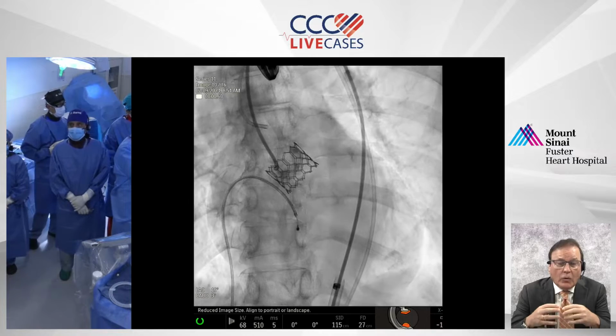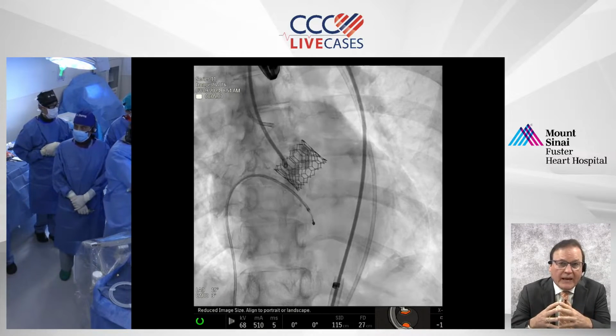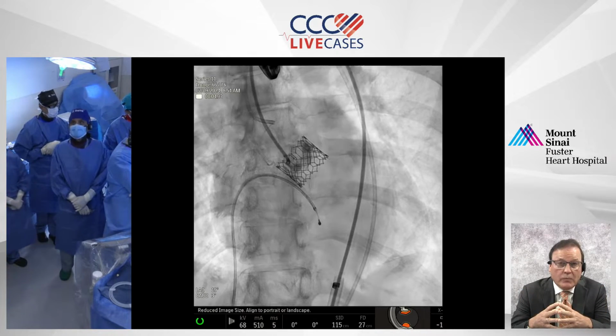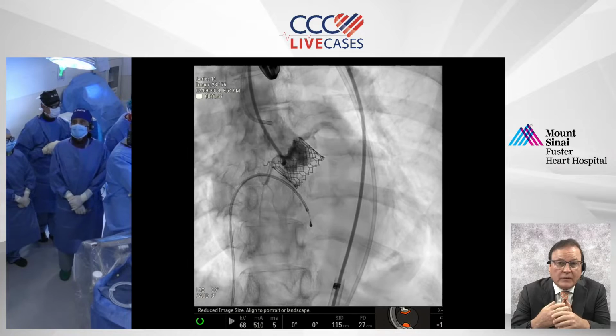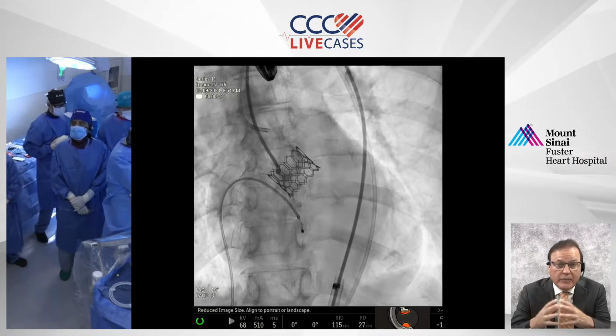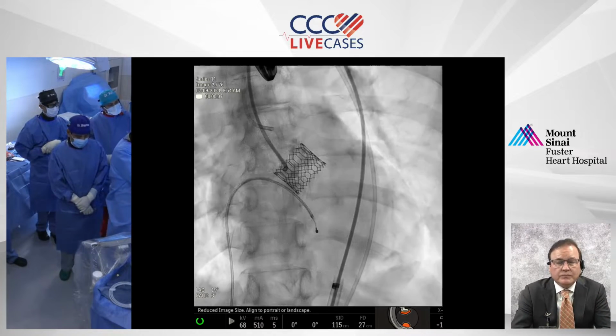Right. So what about using that? I mean, that possibility, protecting the left main, and if we seal the upper part, maybe we will avoid the second valve. The issue is that we have two problems: the PVL that is severe and the left main obstruction. So a step-by-step approach. What about that discussion?